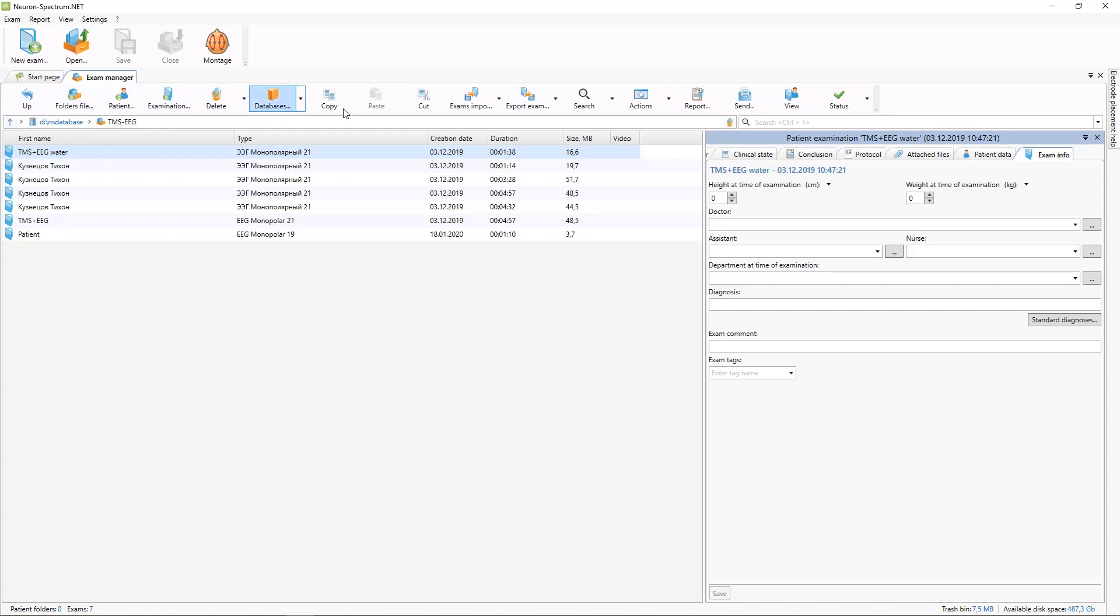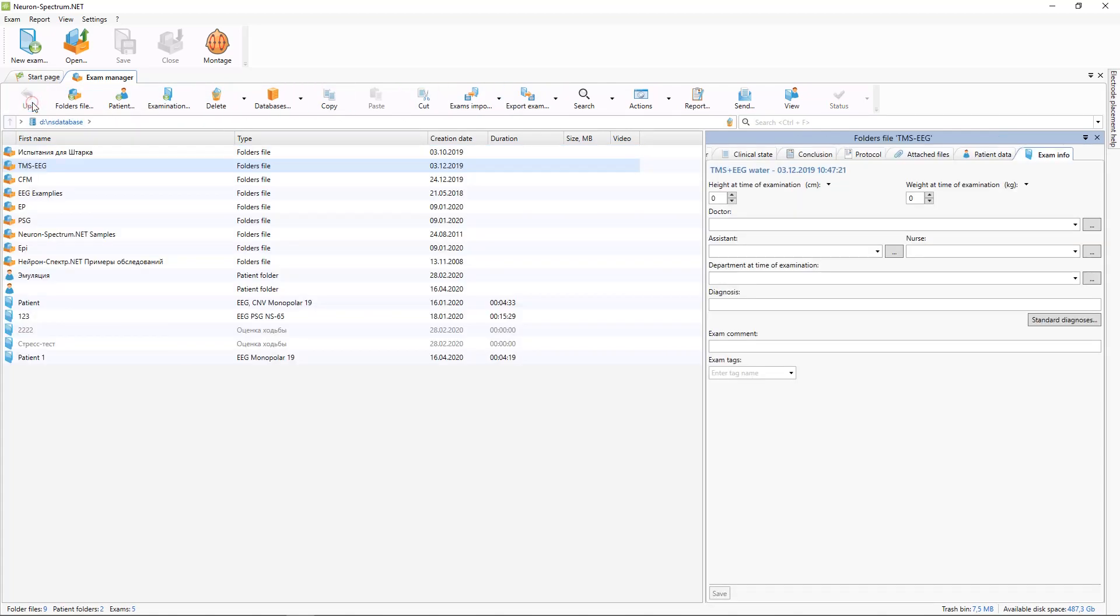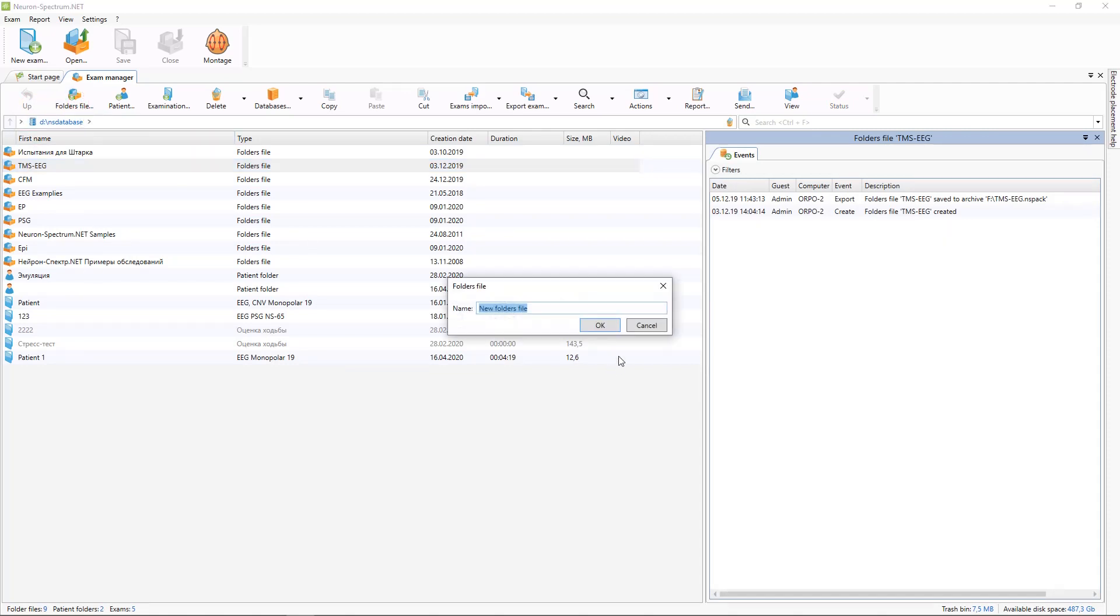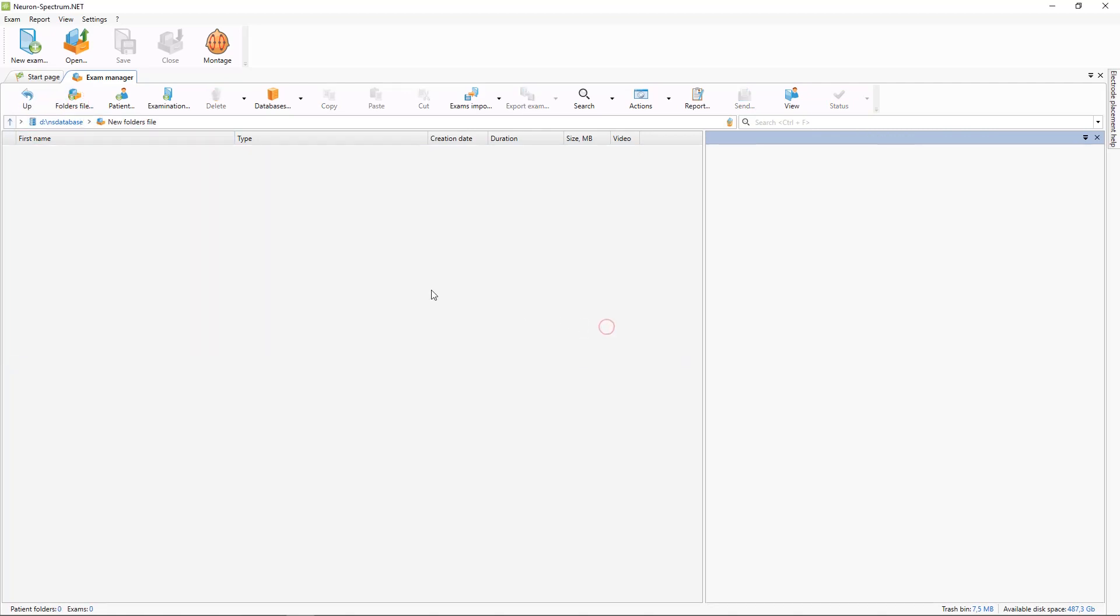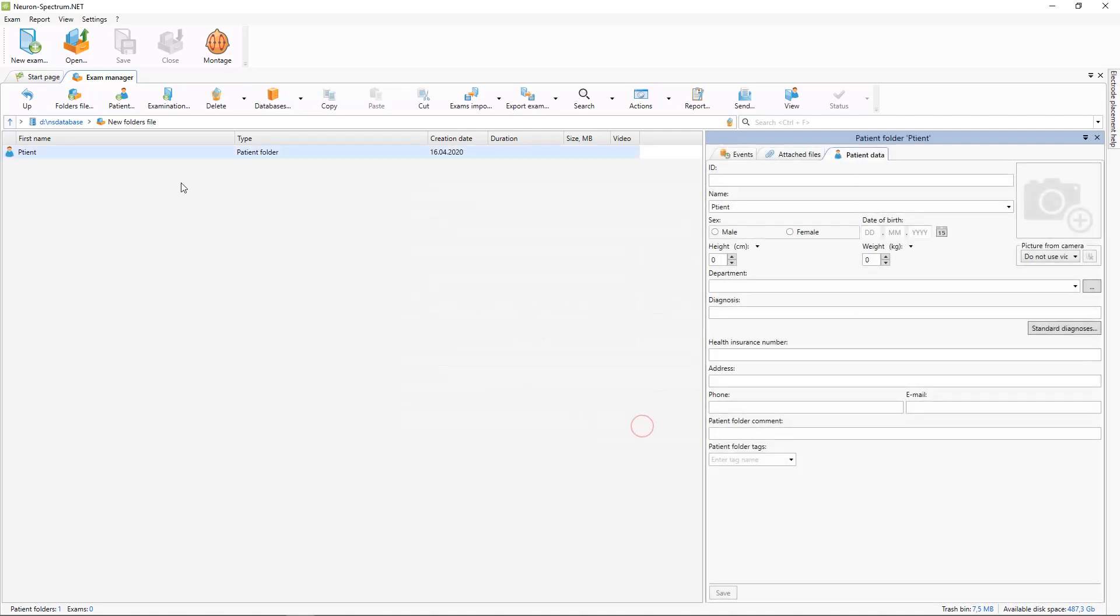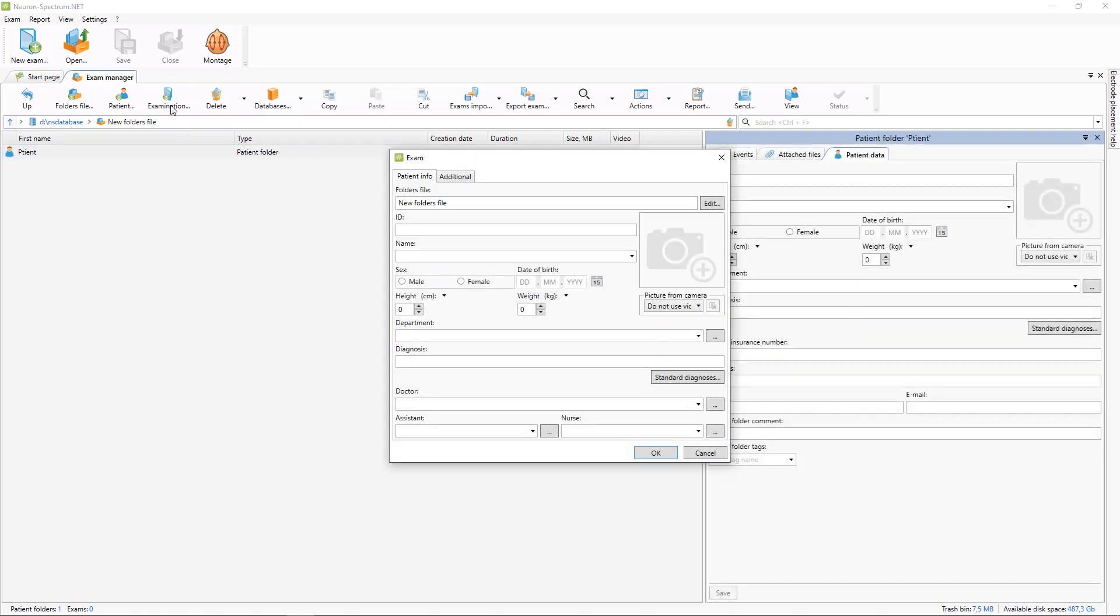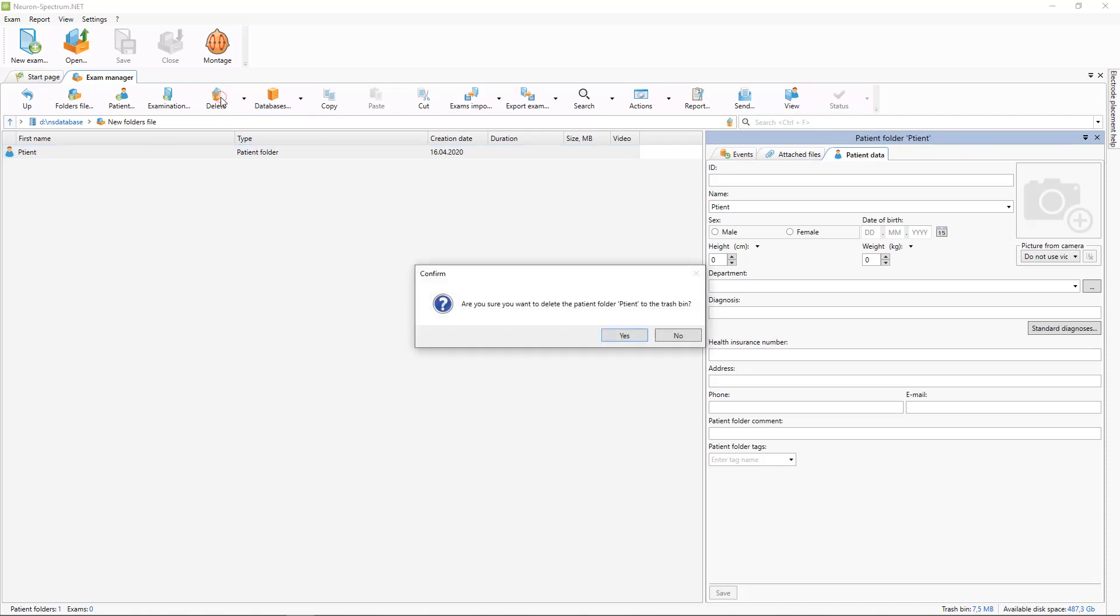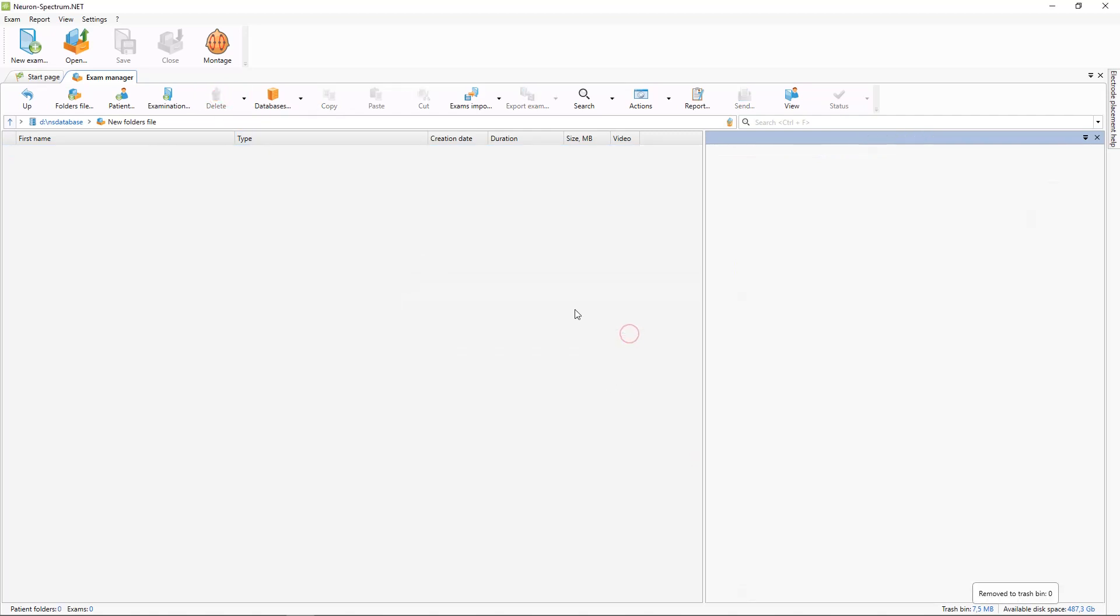With toolbar buttons you can navigate through your database. You can create new folders like this. You can create new patients and you can create new examinations here. Also you can remove selected examinations and patients.